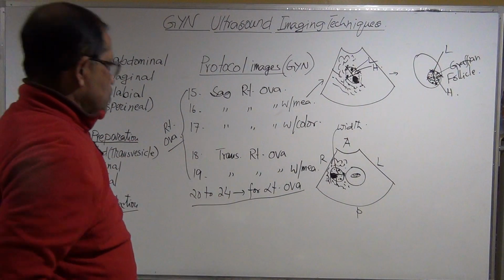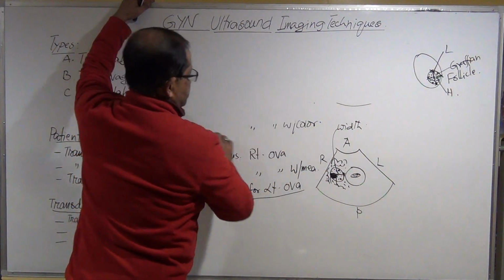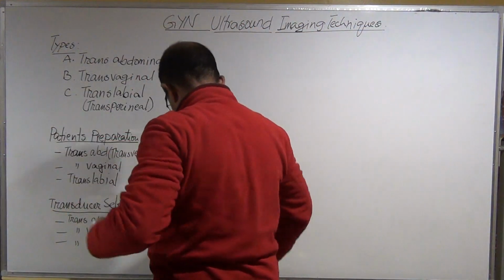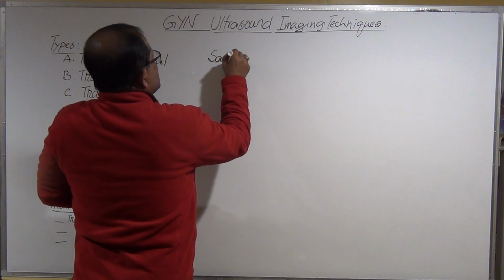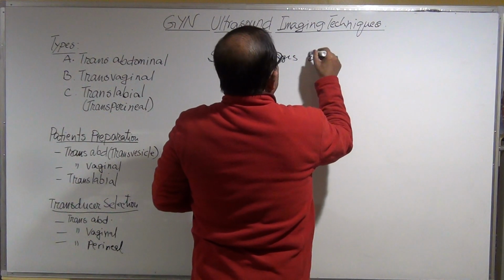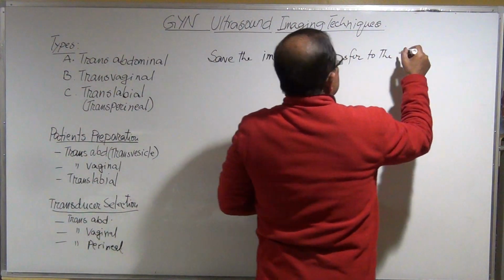You complete the protocol. Okay, so now what happened? The protocol images, you are done. Then save the images and transfer them to the server.